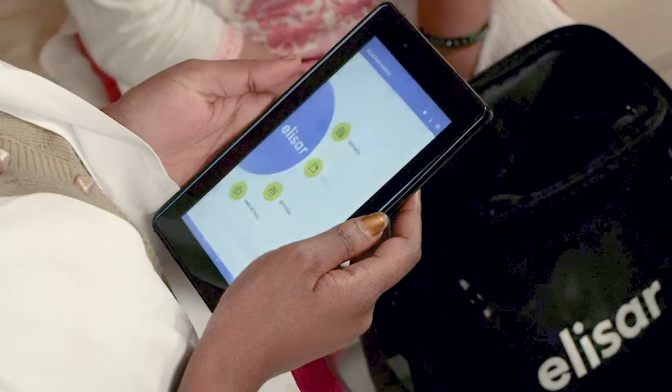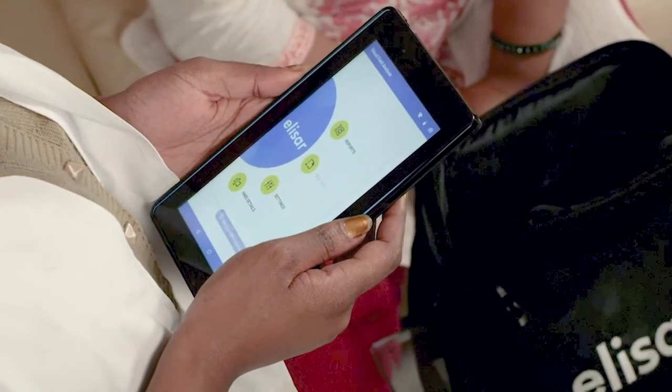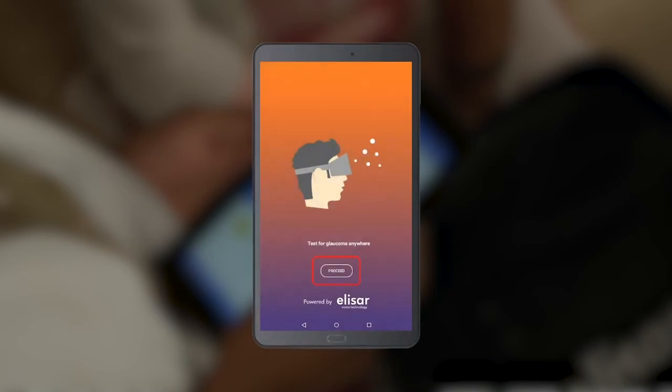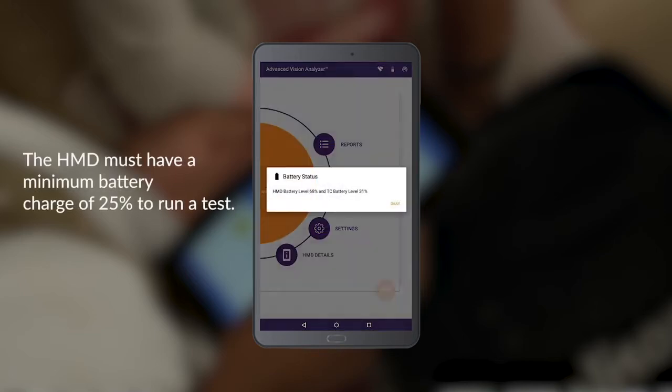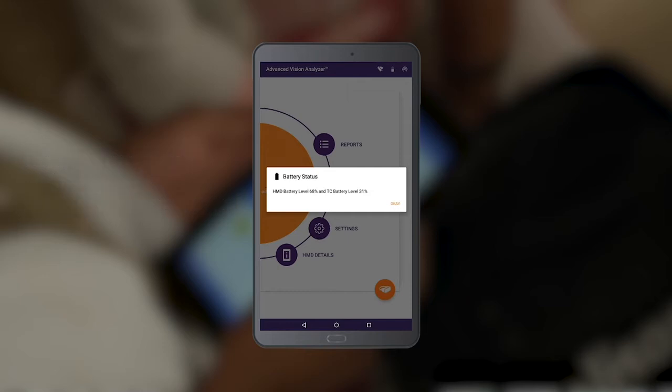Your tablet for the test controller displays a startup page when first turned on. Select Proceed to go to the home page. You will get a notice with the battery levels. The HMD must have a minimum charge of 25% to run a test. If the charge is not sufficient, the tablet will prompt you to charge the HMD. Please make sure you read the IFU for additional details on charging your AVA.